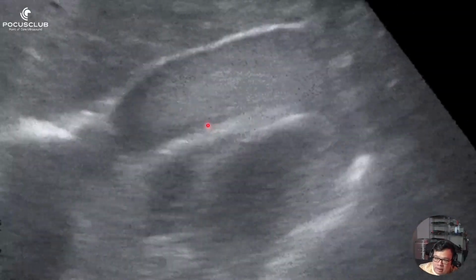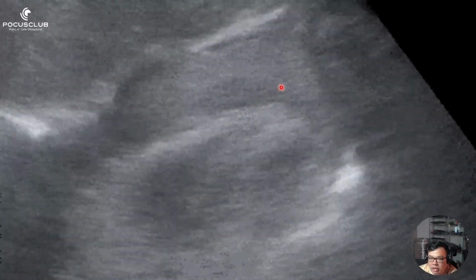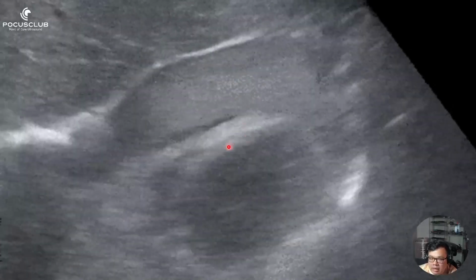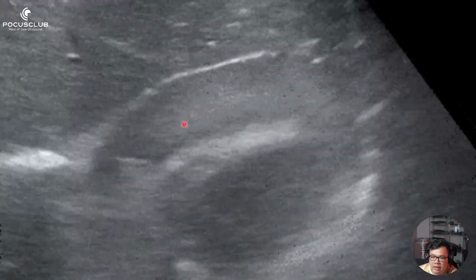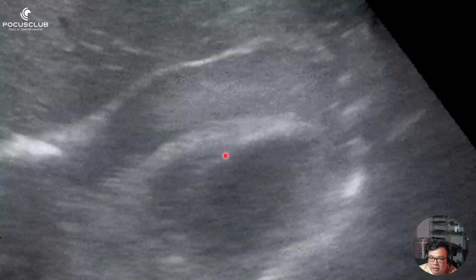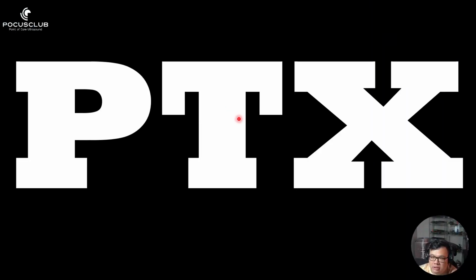Going at this again, this is a pretty large pericardial effusion, quite difficult to see, quite grainy, but again, the right ventricle is not actually filling properly. You see there's no ability for the right ventricle to fill at all, leading to this shock state.